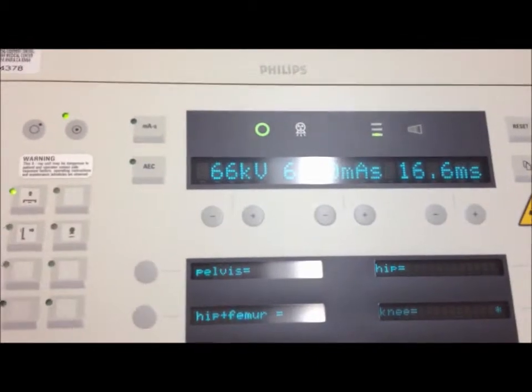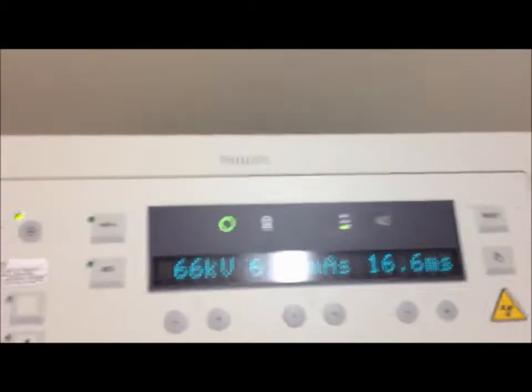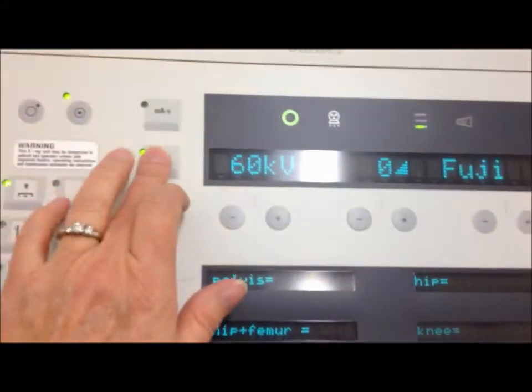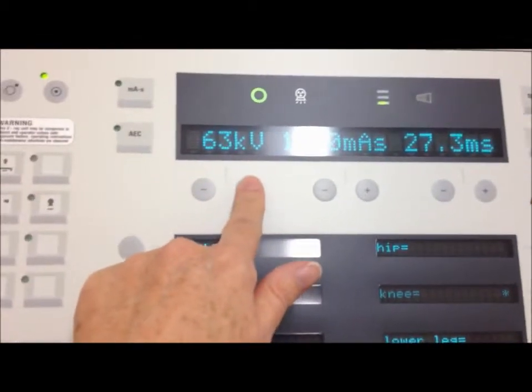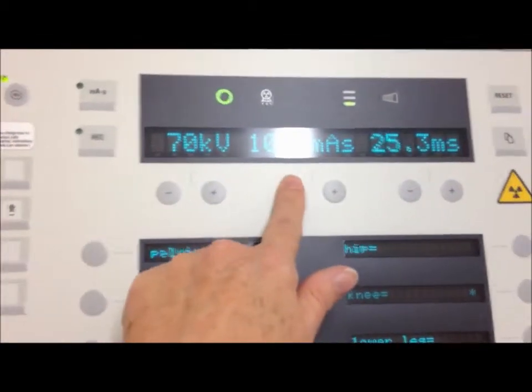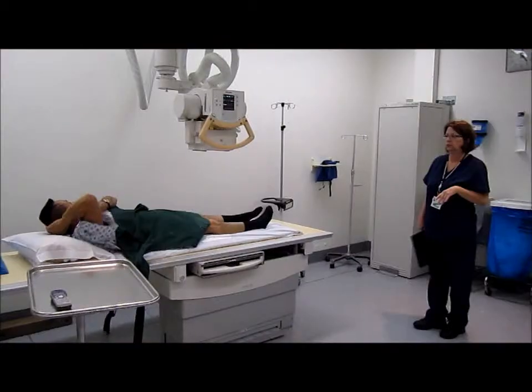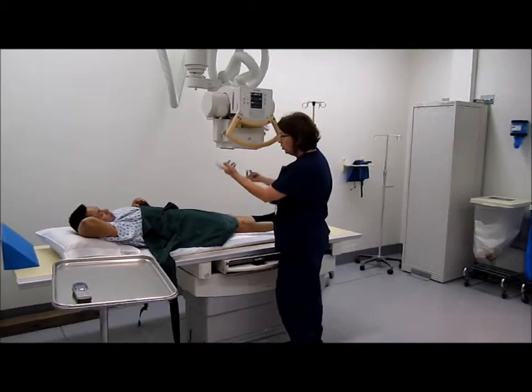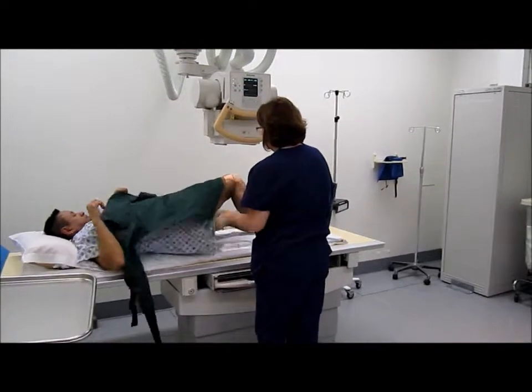For my sunrise knee, I selected tabletop Bucky, selected the knee, turned off my AEC, set my KV at 70, and my mass at 6.3. Okay, Mr. Hogan, now we're going to do the final image. I just need you to roll over onto your stomach. I'm going to put you in the frog position.